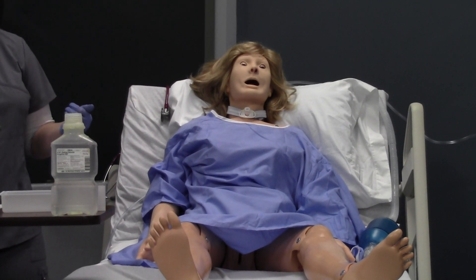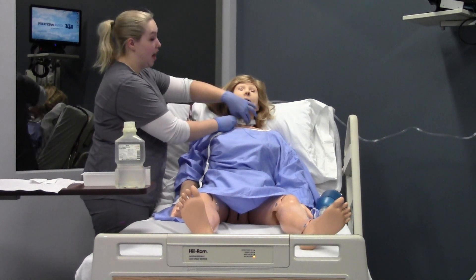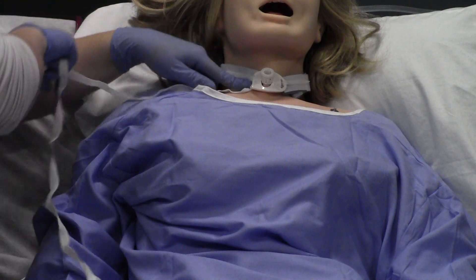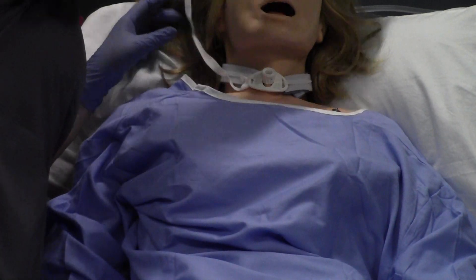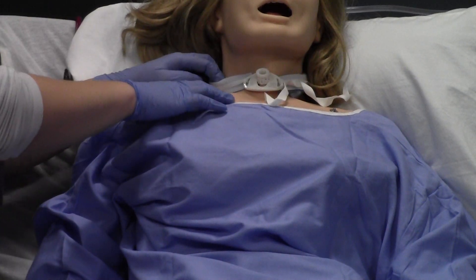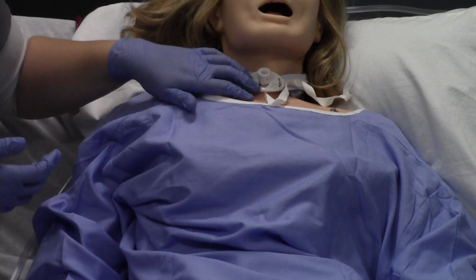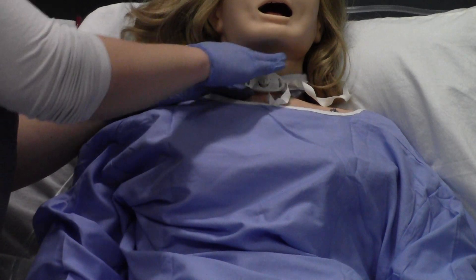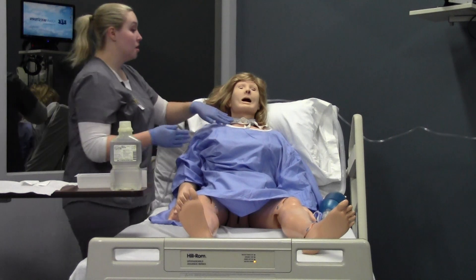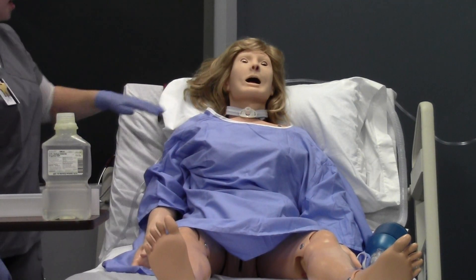Before I put my split gauze dressing underneath, I'm going to change my trach ties — which you are not going to actually do; you're going to verbalize. Your partner holds one side while you thread the new tie through, tie a knot, undo the old set, pass it around while your partner is still holding the other side. Assess the skin all the way around their neck to make sure there's no redness, skin breakdown, or irritation around the site. After changing the ties, make sure there's one to two finger-breadths underneath. Throw the old ties in a biohazard container.